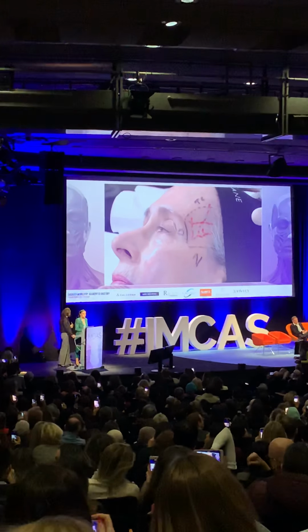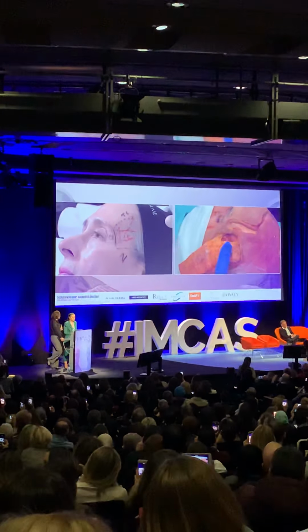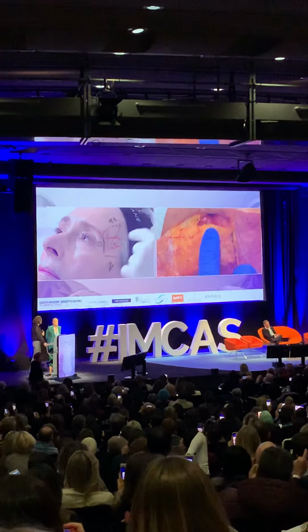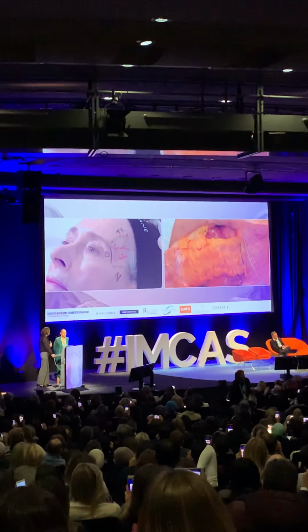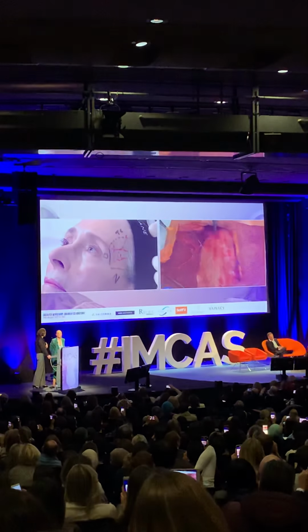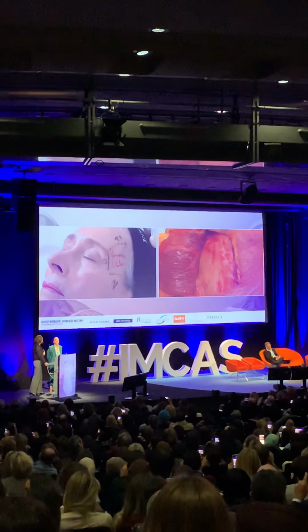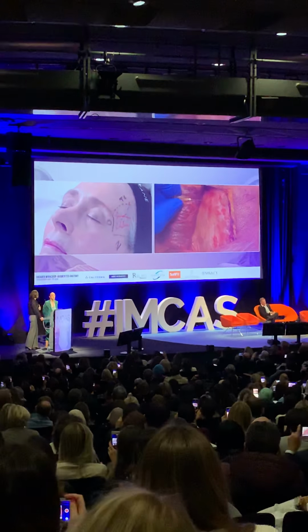But my favorite injection in this area is what I described and published in 2008. It's the gunshot technique. The gunshot technique is a deep bolus injection in the most concave point of this area here, deep to the bone, sliding a little bit. There is a recent article published in PRS that showed that if you slide a little bit, the bevel of the needle will be immediately above the periosteum, so it will not reach any vessels. So it's a brilliant anatomical study published.